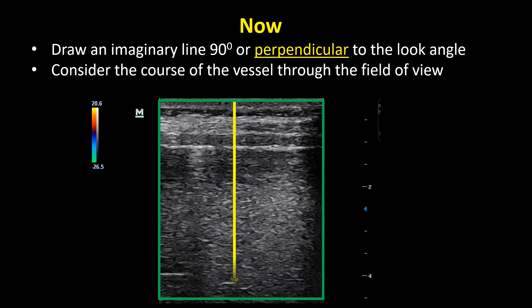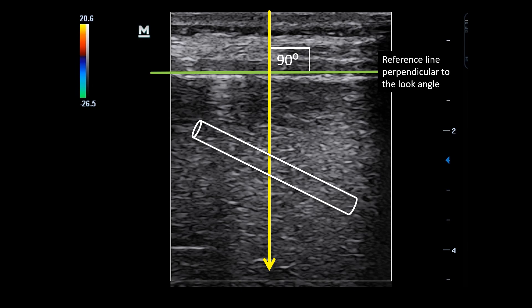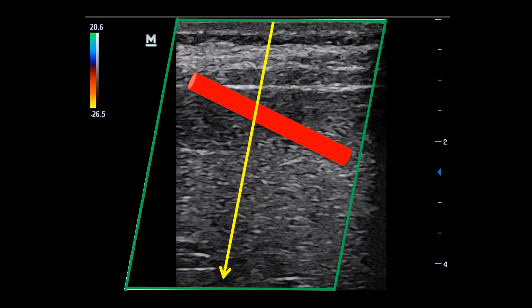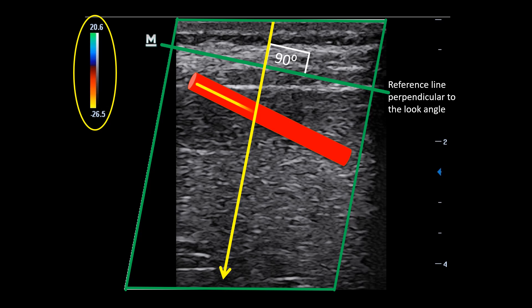What I recommend doing is draw an imaginary reference line 90 degrees or perpendicular to that look angle, and then consider the course of the vessel through that field of view. So if our vessel is red, we check our color box — we know flow towards the transducer or towards that reference line is red, and we know flow in this vessel is moving from right to left. In a similar situation where the color box is steered towards the left, we put in our reference line perpendicular to the look angle, check the color bar, and we know flow away from the transducer is red — so we can determine flow is moving away from the reference line, or from left to right.